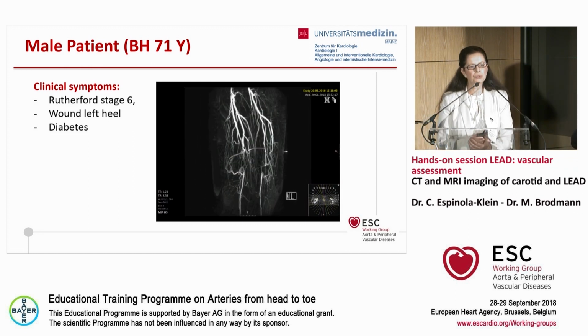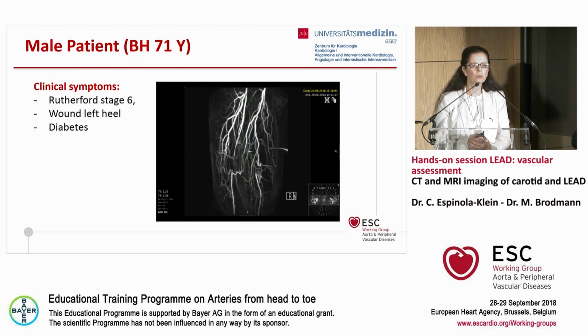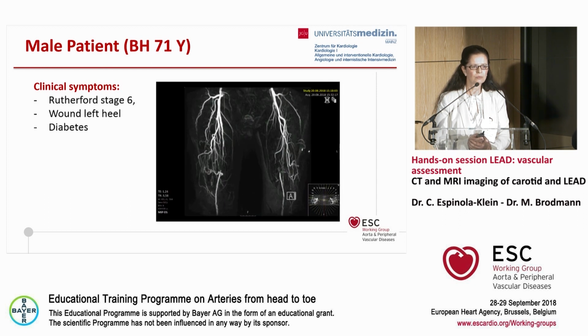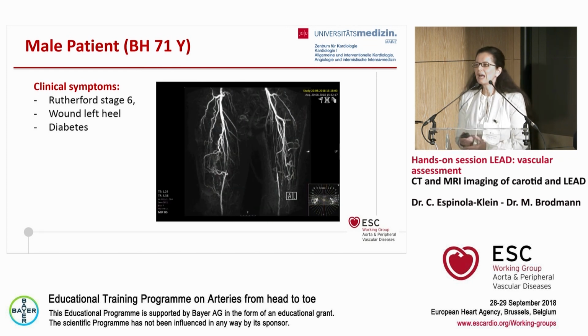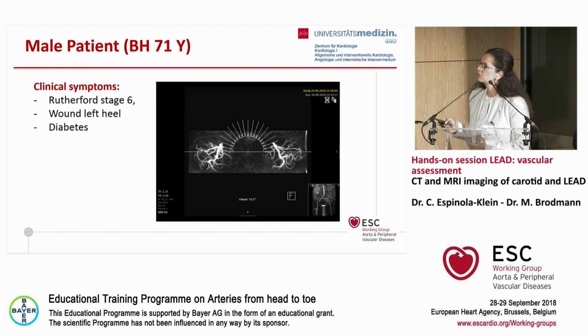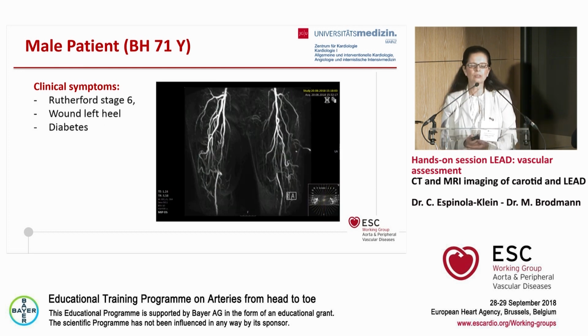Would you treat both sides, or would you decide to treat only the left side? Who will decide to treat the left side first? Nearly everybody, I think so. Well, it depends on the patient. Mostly we have to do something for the wound to heal, and this would be a treatment of the superficial artery on the left side.